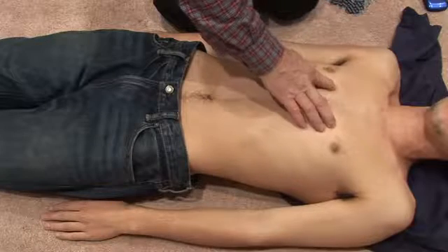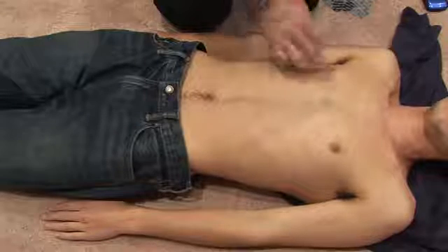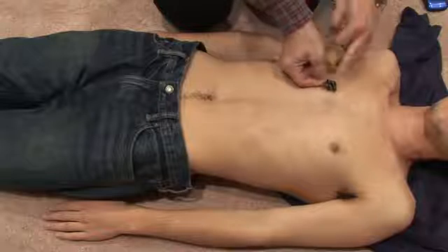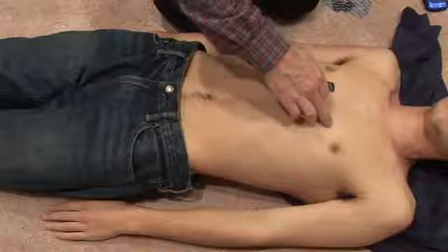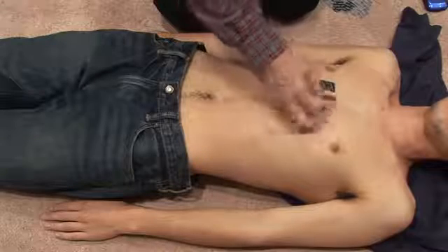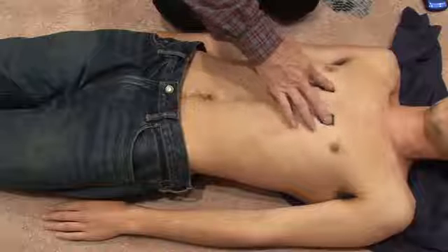Now, V1 should go on the right side of the sternum, where the sternum meets the rib, right in that fourth intercostal space, right about here. And V2 needs to go on the left sternal border at that fourth intercostal space. Okay? So that's very important.